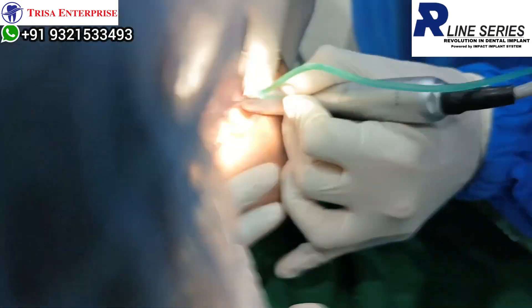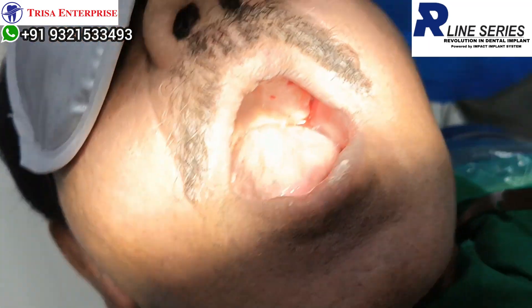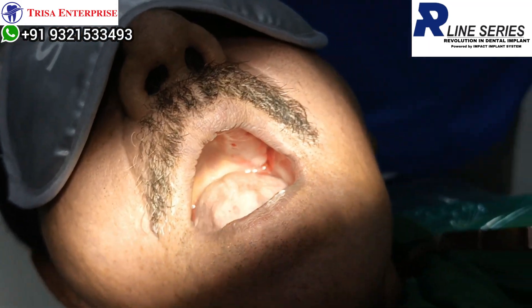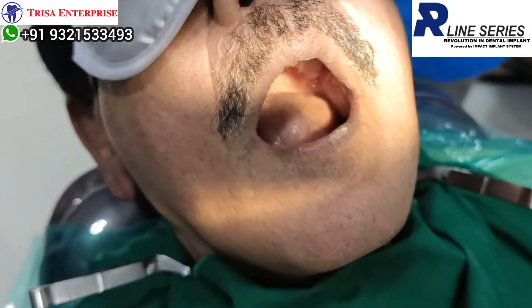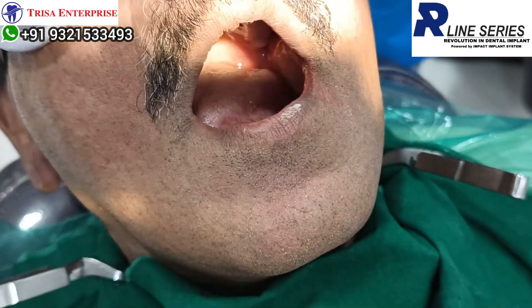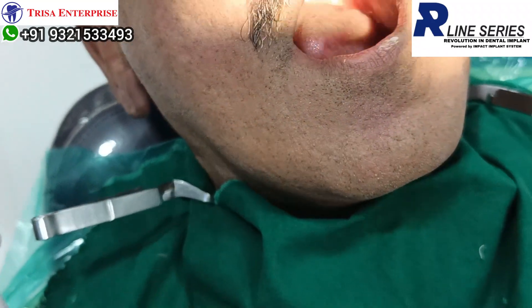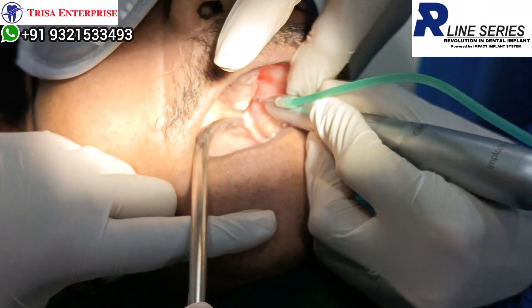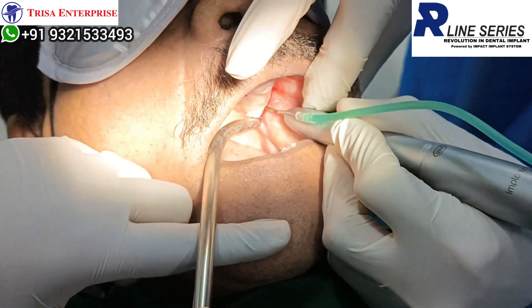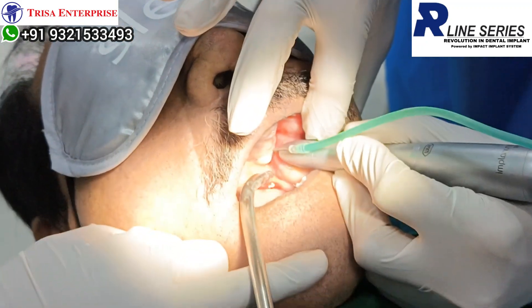Quality of bone is very poor in this area as expected. Next will be my twist drill. Just have to perforate it — I am at 17mm, 3.5 by 17. Done.